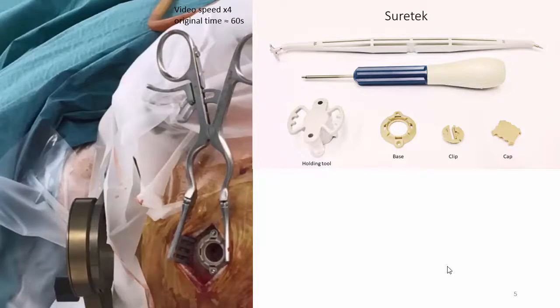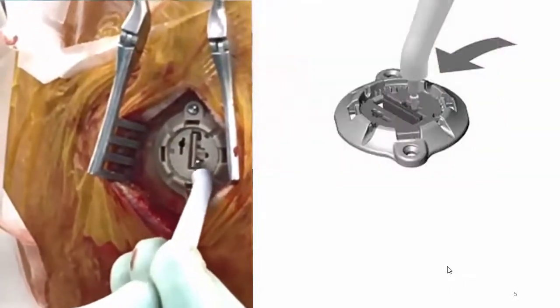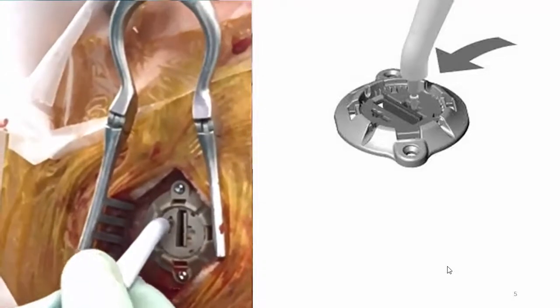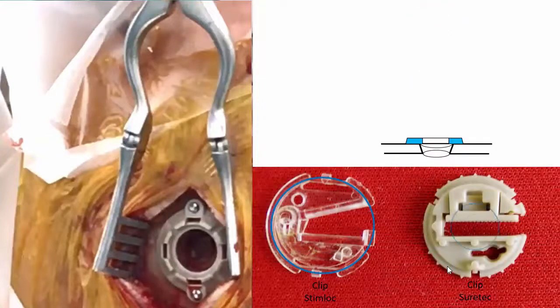The holding tool is then removed when the screws are in place. If you want, you can now insert the clip into the ring to make sure that it fits and can be locked. When the Stimlock from Medtronic is unstable, or when there is a poor fit of the clip in the ring, this is most often because the burr hole is too narrow. If you enlarge the burr hole, then you have solved the problem. This is a problem that I never encountered with SureTek, because the diameter of the part which is inserted into the burr hole is smaller, as seen here.